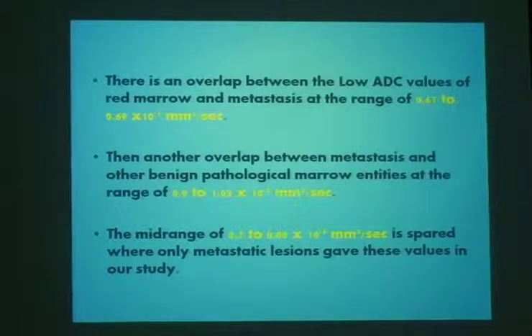Now, according to the distribution, bone scan detected more lesions as regards the skull, the calvarium, and the rib cage, while MRI detected more lesions as regards the appendicular skeleton and the pelvic bones.